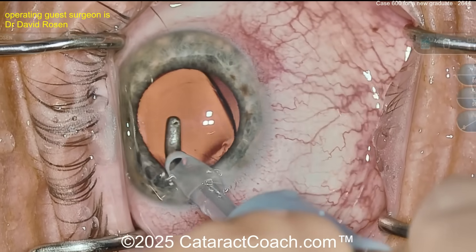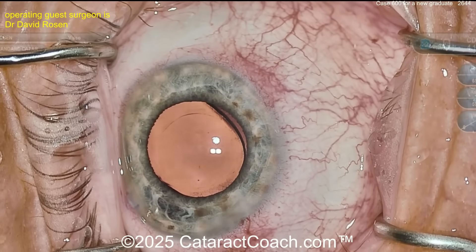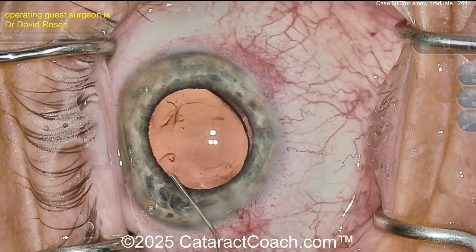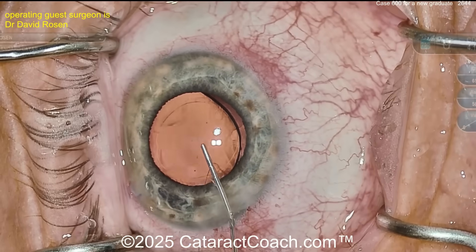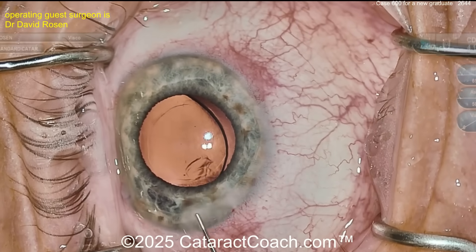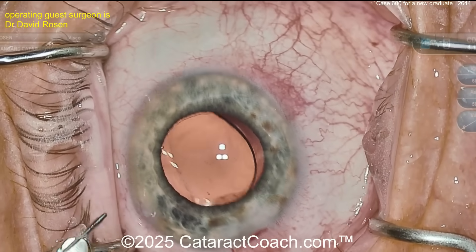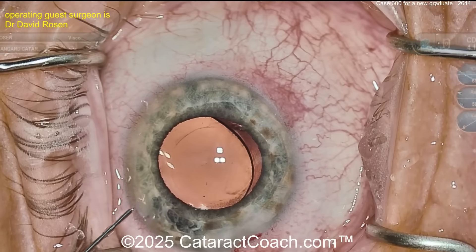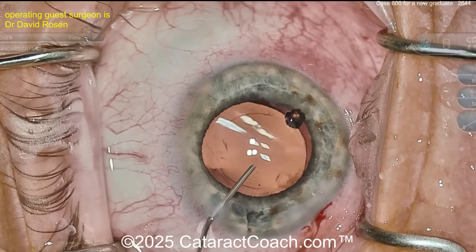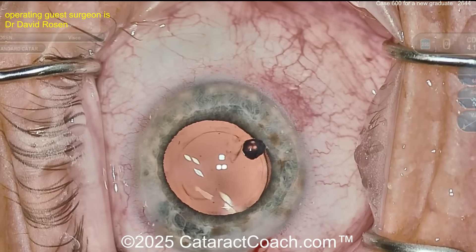I guess it's going to be a happy patient. Get that lens centered up — we'll call this a day pretty soon. It's a really nice case; I think you've done a fantastic job for case 600, definitely keep up the good work. Wash out that viscoelastic — I do that too, but from the paracentesis. You've got to do that angle sweep; with that you'll have a very low incidence of post-op day one pressure spikes. Hydrate the incisions through the paracentesis, make sure the lens is appropriately positioned, then let's get some medication and call this done. Very nice looking case.